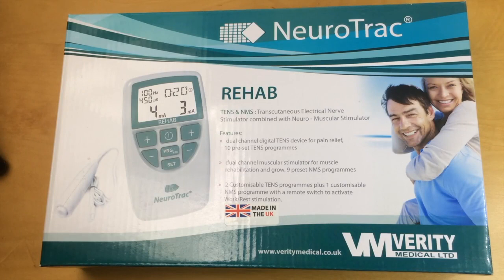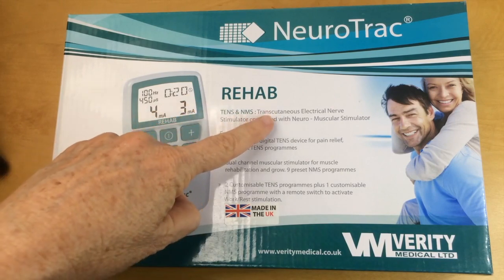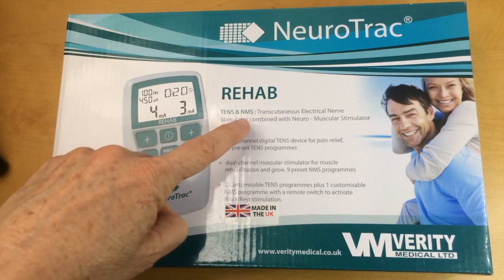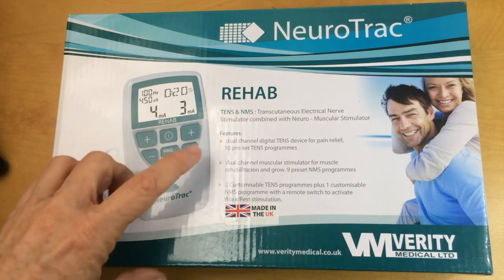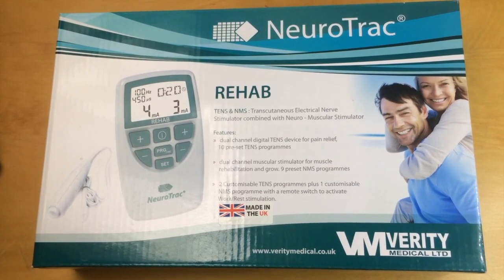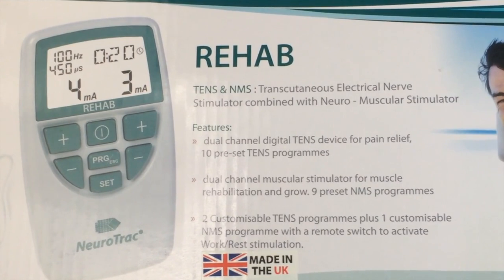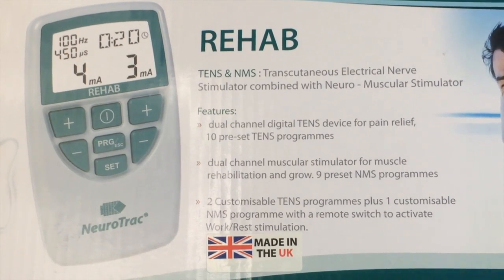I'll start by going through the features on the outside of the box and then we'll get inside. You can see that it offers both transcutaneous electrical nerve stimulation or TENS and neuromuscular stimulation or ESTIM for short. The difference between these is that TENS is usually used for pain, and NMS or ESTIM is used to stimulate muscle activation.